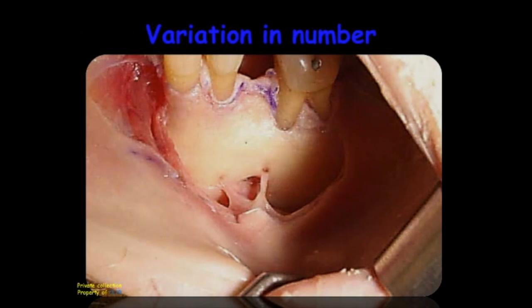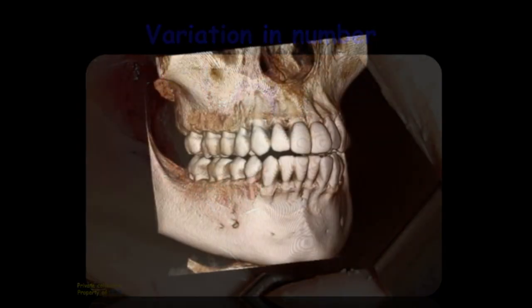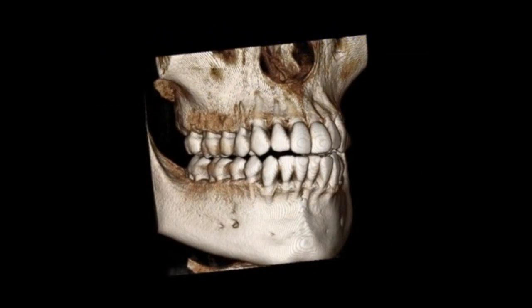In 1% of cases, we may have a triple mental foramen, like in this clinical situation. On this CBCT reconstruction, we can see the three exits of the mental foramen.